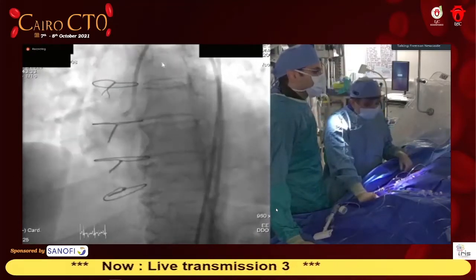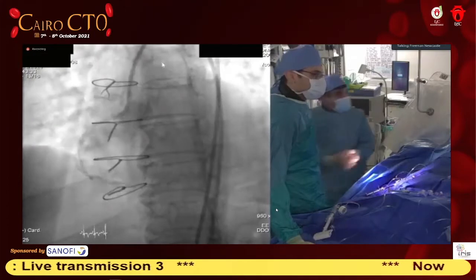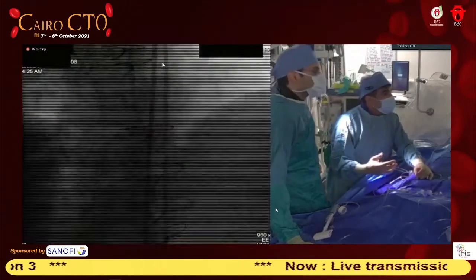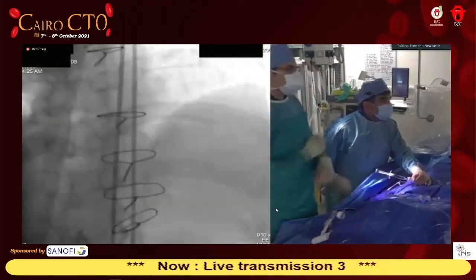So, I suppose if I were there, I would ask for a show of hands: who would coil the graft, or who would leave it? Maybe you could do that for me, Amr or Adil. What do you think? The question is, who will leave the graft and who will close it?